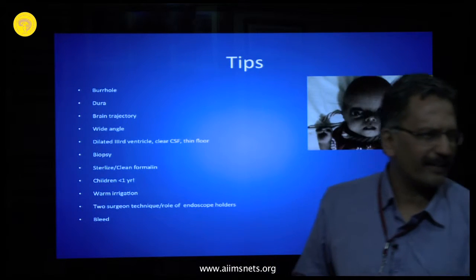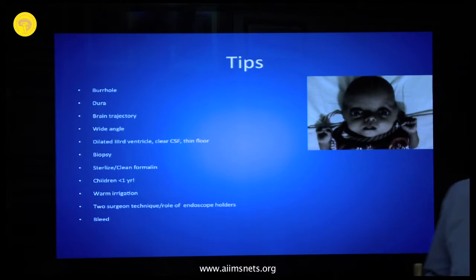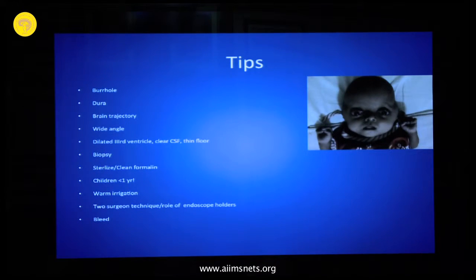And I have realized, you rely on your residents and they will sometimes leave some little bleeding points there. It goes along the trajectory, and when you are putting an endoscope there, it's all hazy. So that's something that you really need to focus on. There has to be complete hemostasis, and when you are perforating the pia, when you are going into the brain, just make sure that you have coagulated all the edges, because along the track, even if there is a little blood going into the ventricle, it makes the whole ventricle hazy, and you don't want any blood in the ventricle before you do your endoscopy.